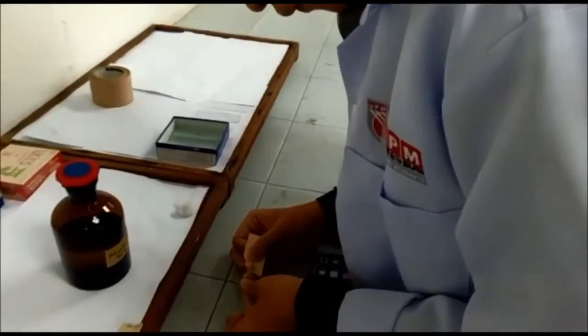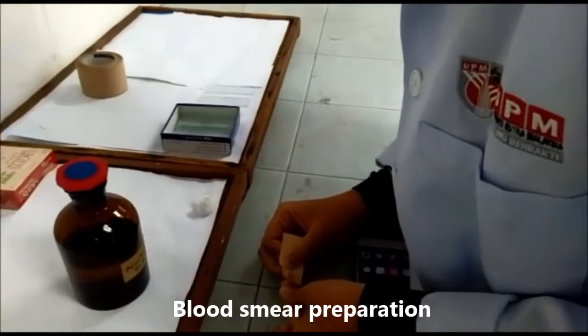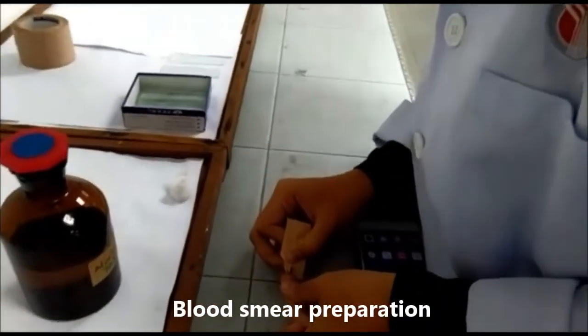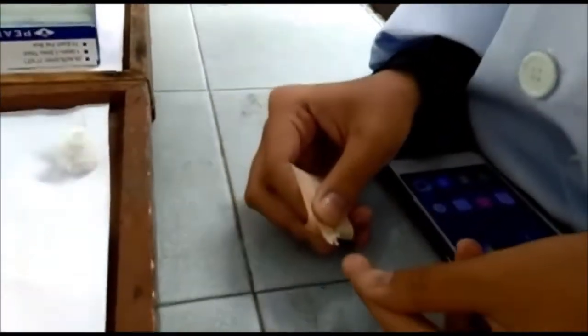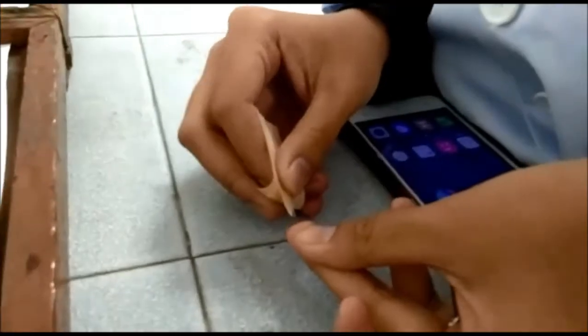Okay, now we are going to do blood smear. So firstly, we need to take our own blood.